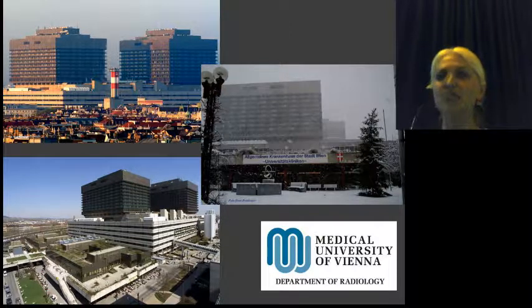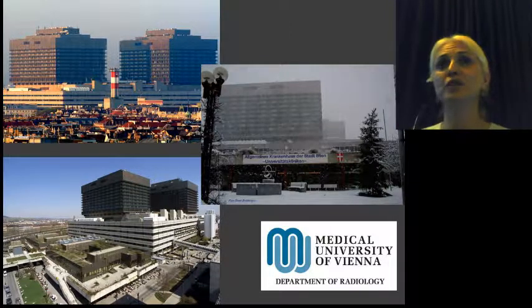A second one, ASL: I don't do much ASL for this infectious lesion. So I can't answer this question. We always do contrast enhanced normal perfusion. So ASL, a little bit for tumors, but not for this infectious lesion.